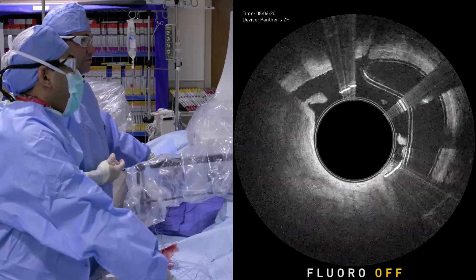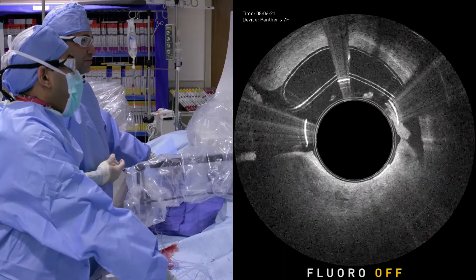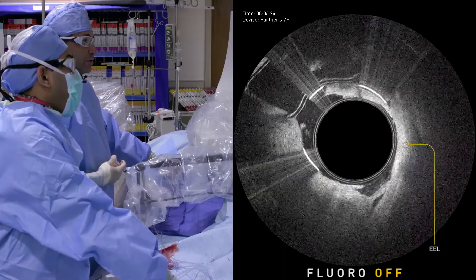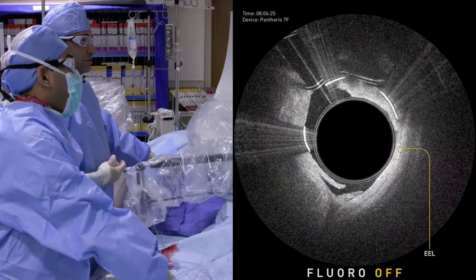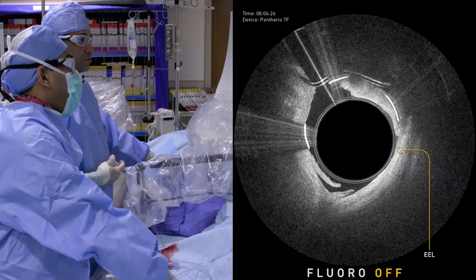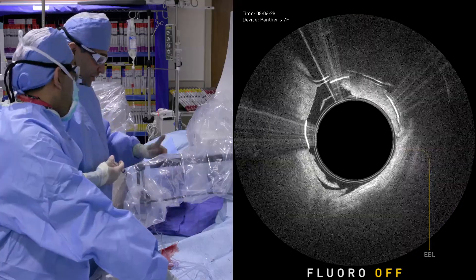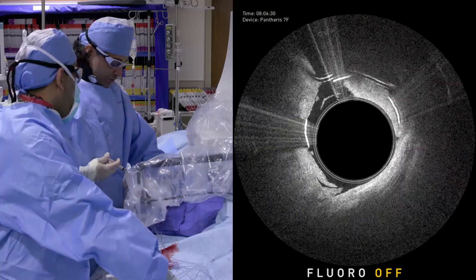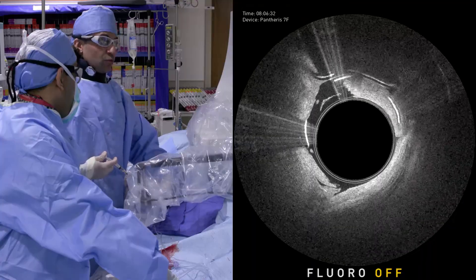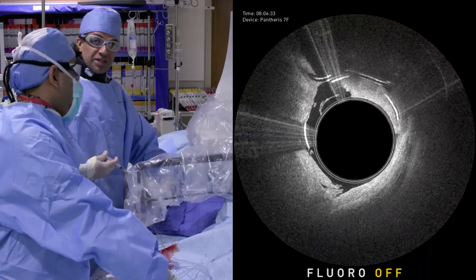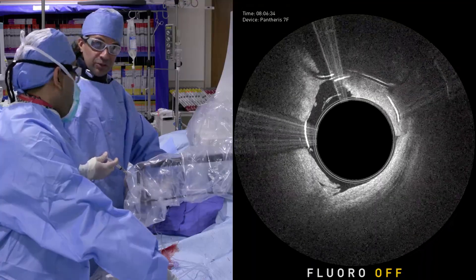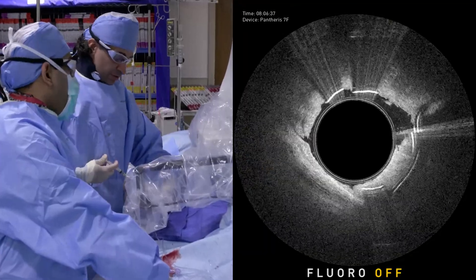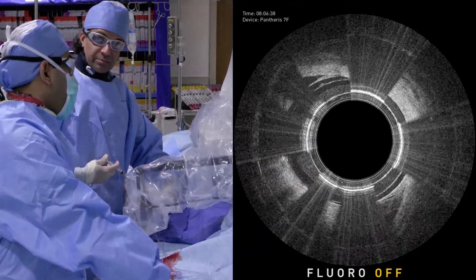So I'm going to continue to advance. I'm going to give a little bit more balloon here. Now there you see how close we are to the media adventitia line. This is very important. What you want to do first, before you deflate the balloon, you want to stop or close the cutter. So I'm going to close the cutter completely.